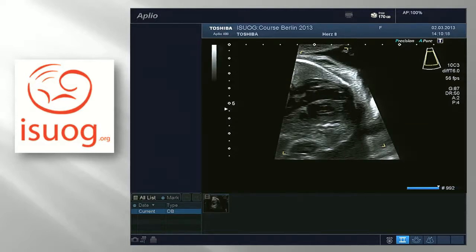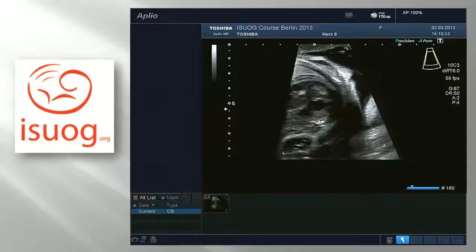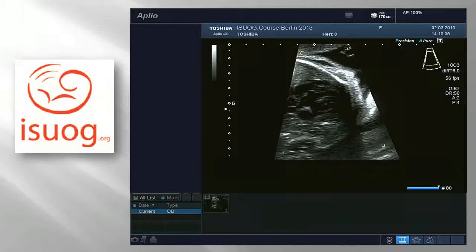So in this view, which is a left ventricular outflow tract, it's nice to see the continuity here between the septum and the anterior wall of the aorta with the aortic valve. So I just wanted to freeze and then go back to see the aortic valve closed in here. And then it opens and it closes, maybe a bit more again. Open and close, open and close, so that's a normal valve.